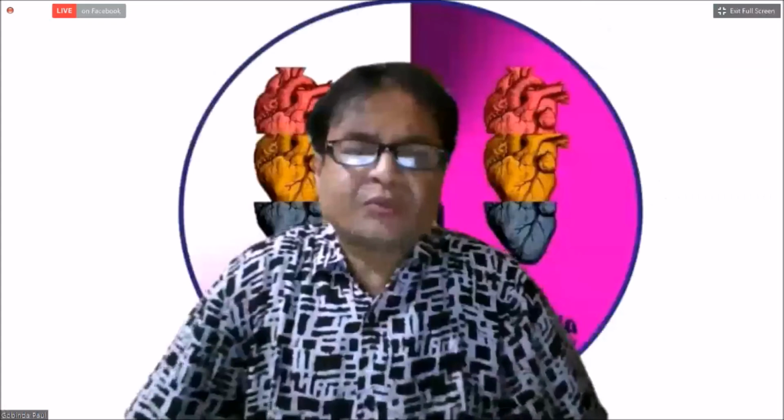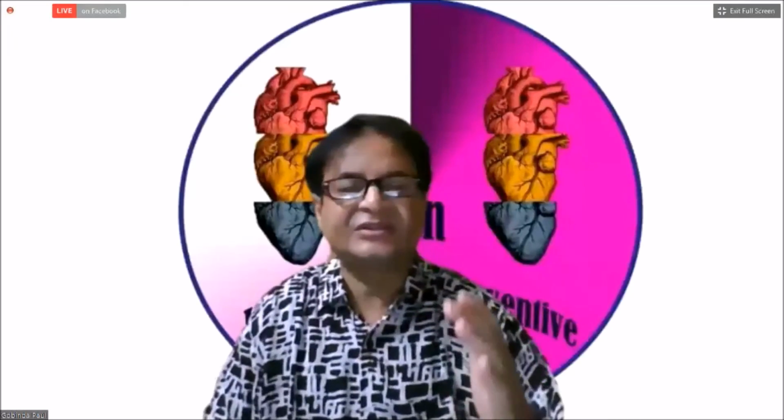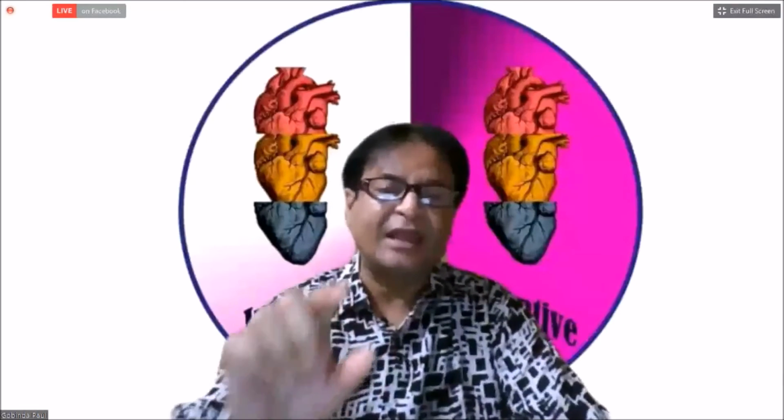Thank you, Dr. Robiul Islam Sarker. I think we should proceed to the next question. For measurement of TAPSE, which line is considered, vertical or angulated line? Of course, angulated line, because the lateral tricuspid annulus moves towards the apex. For that reason there is some angulation, not vertical. It is the annular movement towards the apex. And height, when the image is created in M-mode, here also a height.